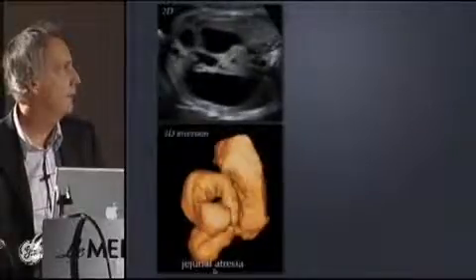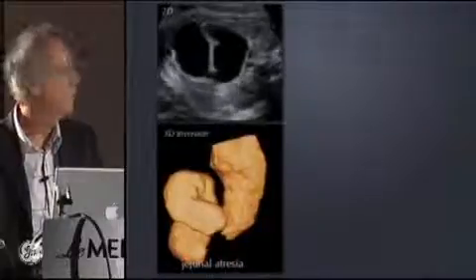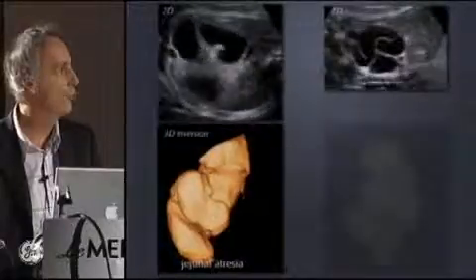a jejunal atresia, 2D and 3D, a pyelectasis, hydronephrosis, and the 3D rendering.